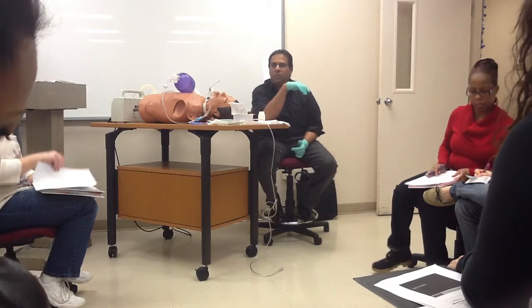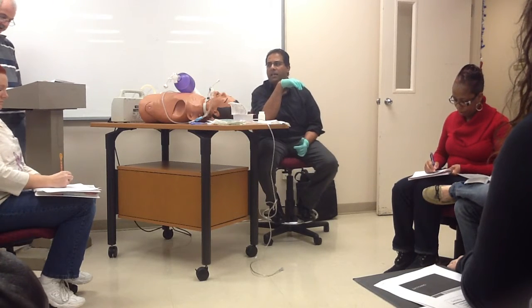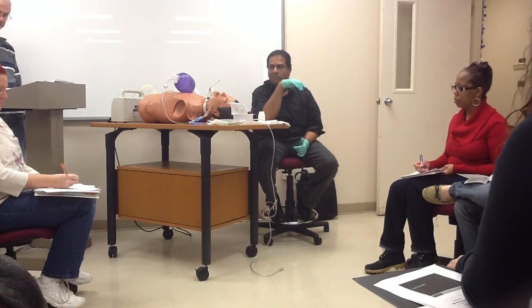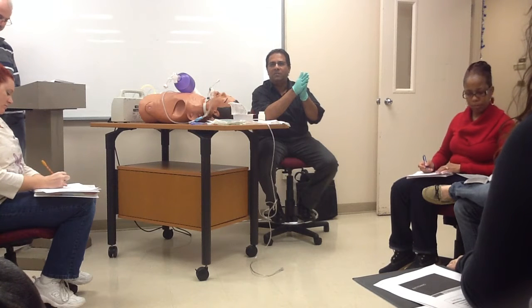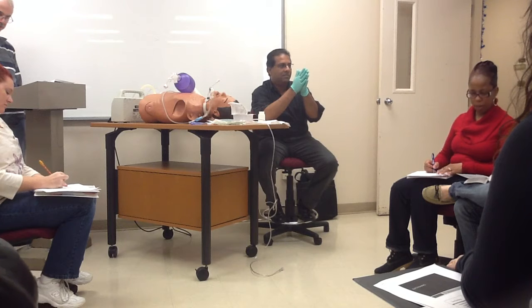So if my trach size is number 6, what's my suction catheter size? 3 times 3 is 9, plus 2 is 11. We don't have an 11. So it's a 10 or a 12. Smaller rather than larger.